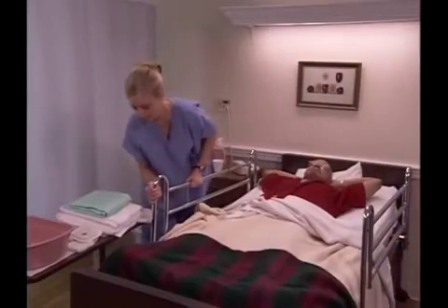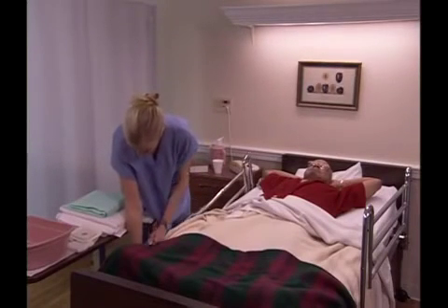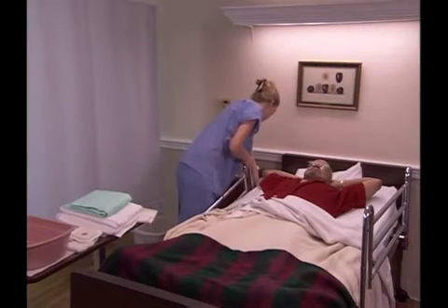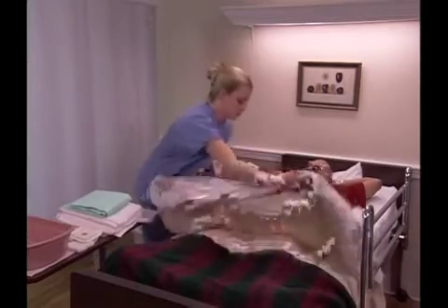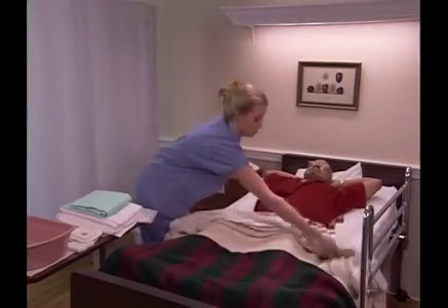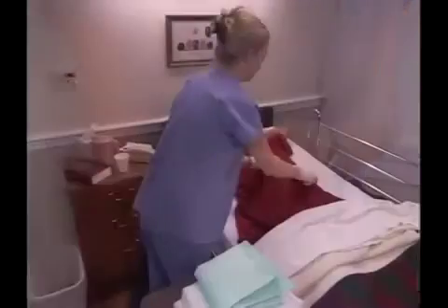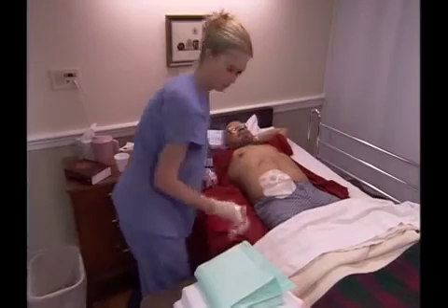Make sure the wheels are locked. If the side rails are in use, lower the side rail on the working side of the bed. The side rail on the opposite side of the bed should remain up. Fan fold the top linens to below the person's waist. Put on your gloves. Adjust the person's clothing as necessary to expose the stoma.